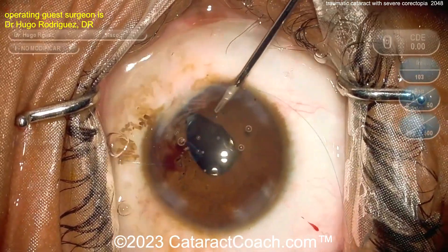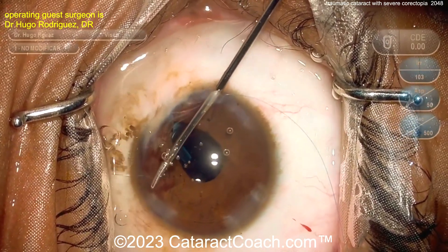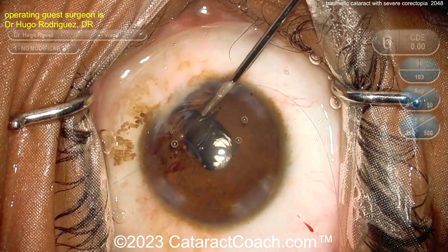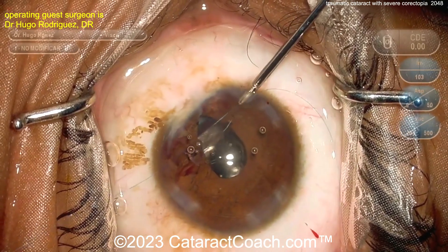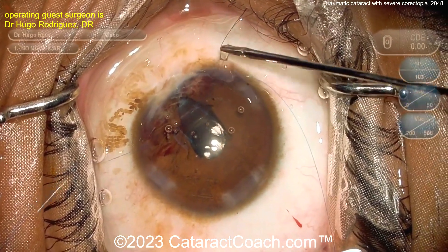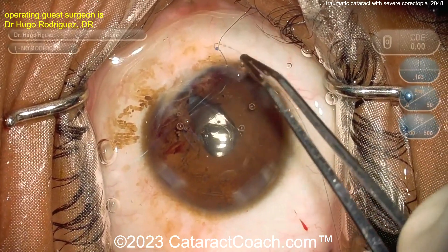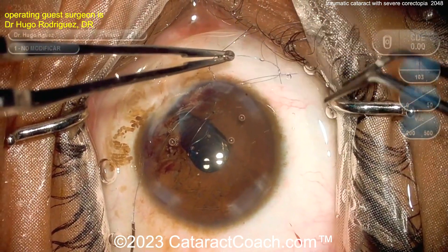You can use the Agarwal four-throw pupilloplasty technique, which is a very straightforward way of tying this up. Grab one end, bring it out, and the four-throw technique involves throwing four passes and then tightening. Bring the loop outside the eye so you can access it. There are great videos on this technique at cataractcoach.com — go to the search box and type in 'pupilloplasty.' Pass the suture end through the loop four times: one, two, three, four — then cinch it down.